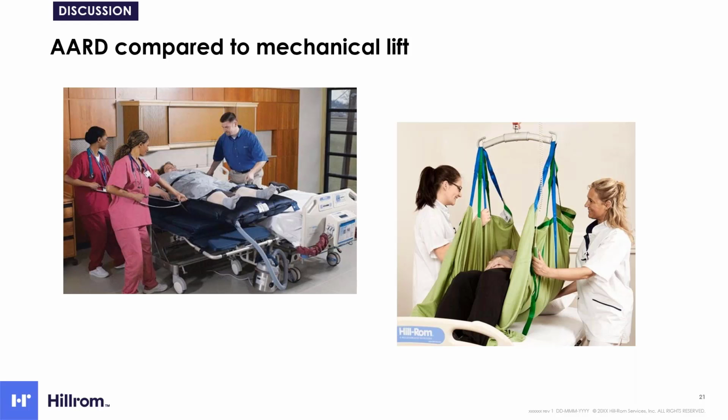That is another concern. The AARD is not as versatile as the mechanical lift. Besides repositioning patients in bed, the mechanical lift can also be used for many other activities. For example, transferring the patient from a bed to a chair and back to a bed, and mobilizing the patient. All these activities are also known to have risk of injury, and the mechanical lift can help with that, but the AARD cannot.